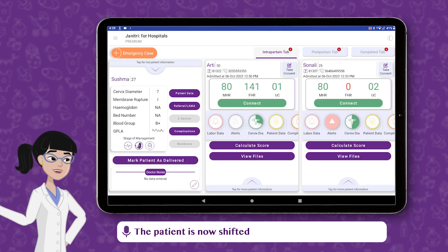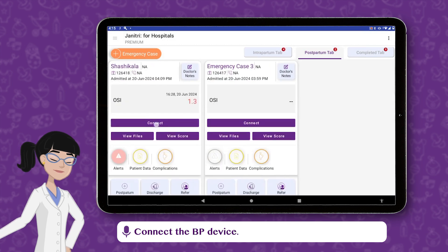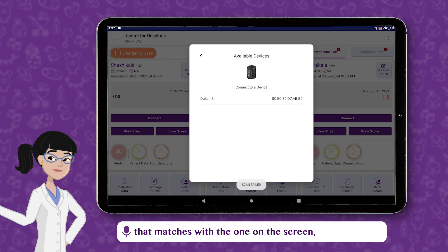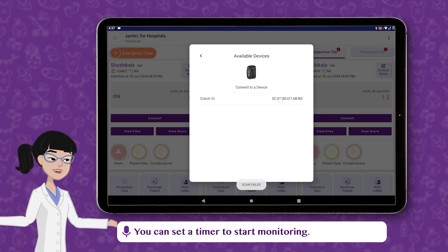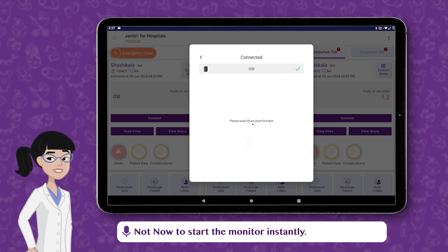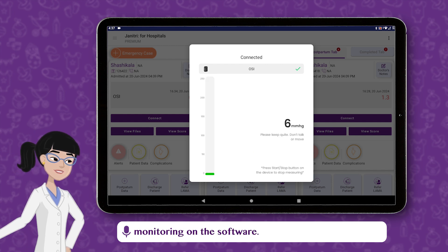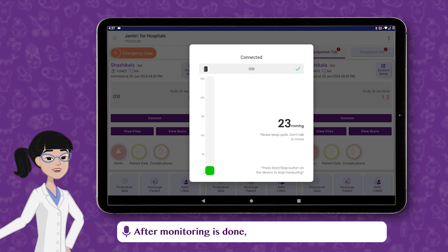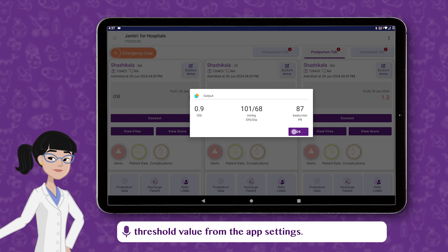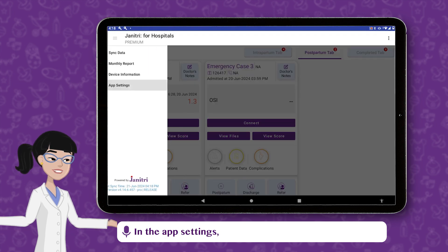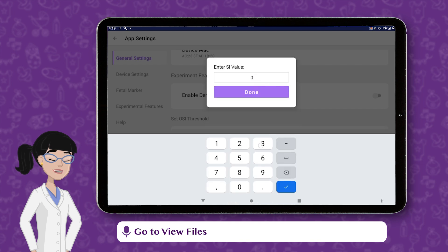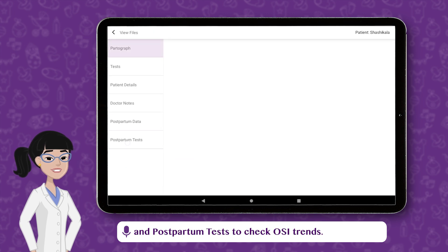The patient is now shifted to the Postpartum tab. Connect the BP device — check the serial number on the device that matches with the one on the screen and select the device. You can set a timer to start monitoring, or tap Not Now to start monitoring instantly. You can check the real-time monitoring on the software. After monitoring is done, the output will be shown on the screen. You can set the OSI Threshold value from the App Settings — scroll down to find OSI Threshold value and set the value.